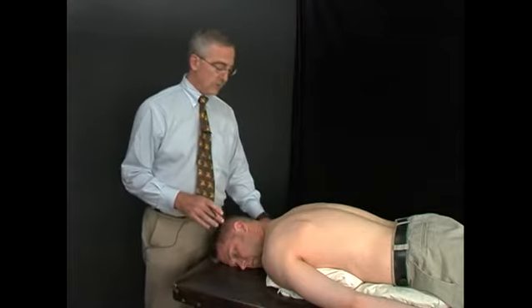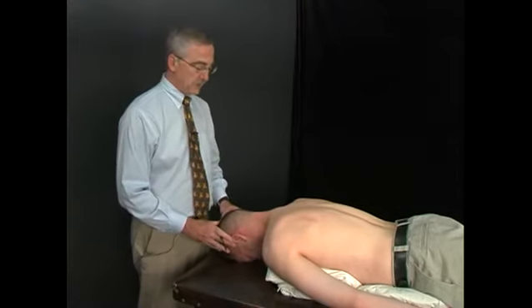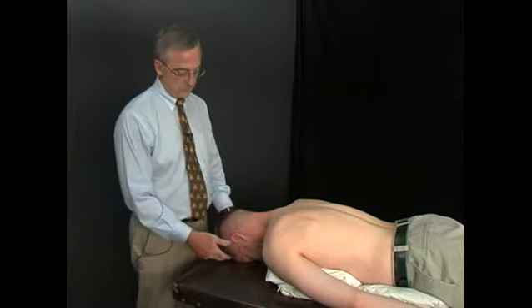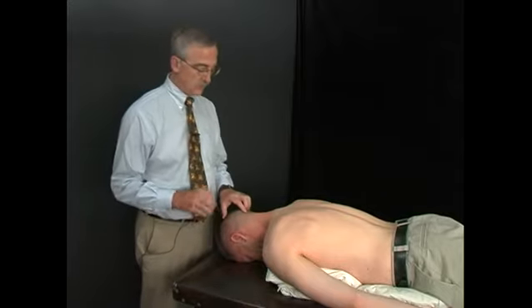We're going to start with the cervical area, and I'm going to have you put your head in the middle. The head is in the midline. It helps to have a table with a cutout in it, but you can also put a little lift under the forehead so that the nose doesn't get too scrunched.